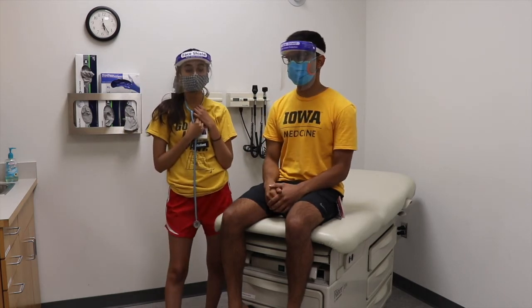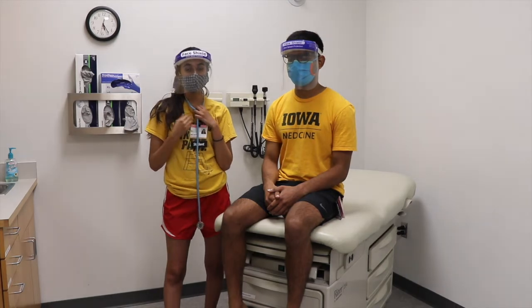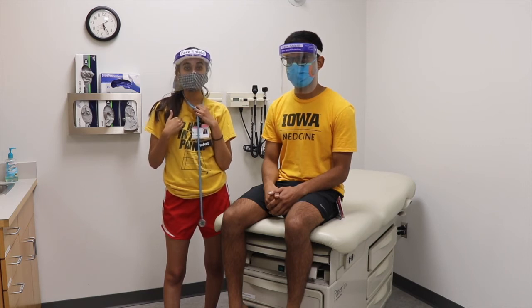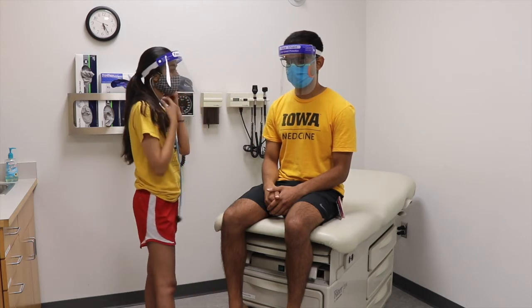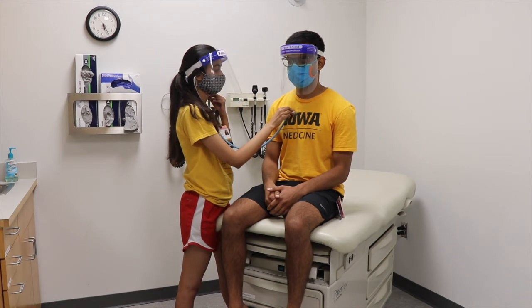So first, we've got 4 different valves. The first valve we're going to listen to is the aortic valve. We usually listen to this on the right side of our sternum, which is this bone right here. We listen to it on the right side in the second intercostal space. An intercostal space is the space between 2 ribs, and the second intercostal space is about right here. So to listen for it, we would listen about right here.